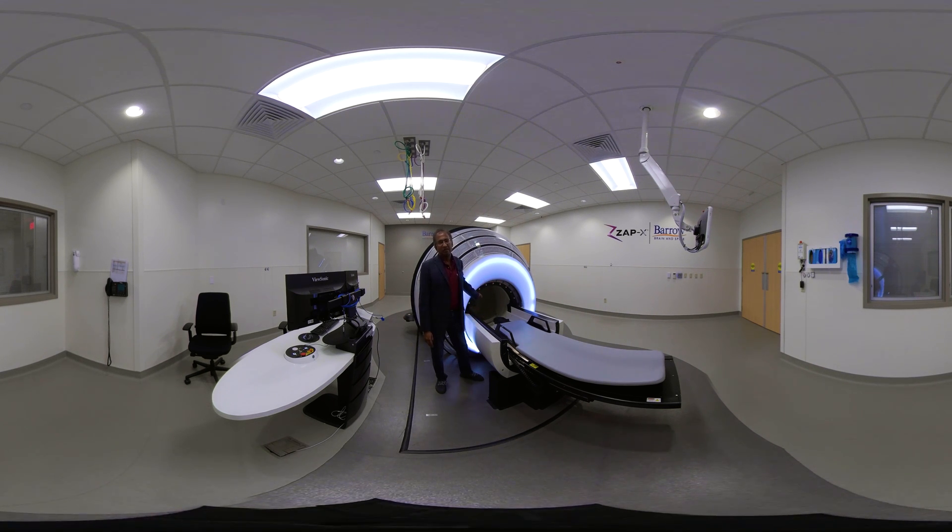We also have windows inside, so the patient can see outside and doctors can see inside — it's very comfortable. This particular table has three degrees of freedom: it can go in and out, left and right, and up and down. This is how we make sure that the target — the tumor — is exactly at the isocenter at all times, right in front of the beam. We also have a shell that closes and a door that goes up.